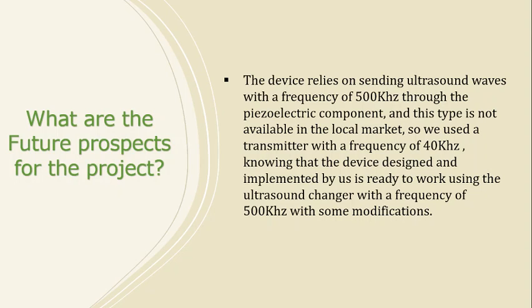The device relies on sending ultrasound waves with a frequency of 500 kHz through the piezoelectric component, and this type is not available in the local market, so we used a transmitter with a frequency of 40 kHz. Knowing that the device designed and implemented by us is ready to work using the ultrasound transducer with a frequency of 500 kHz with some modifications, like adding a circuit to generate the 500 kHz frequency and the addition of a thermal sensor to monitor the temperature of the part that the waves pass through.